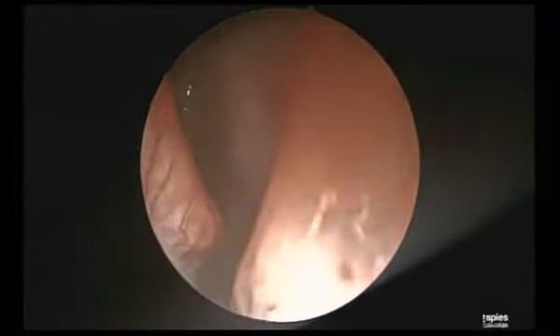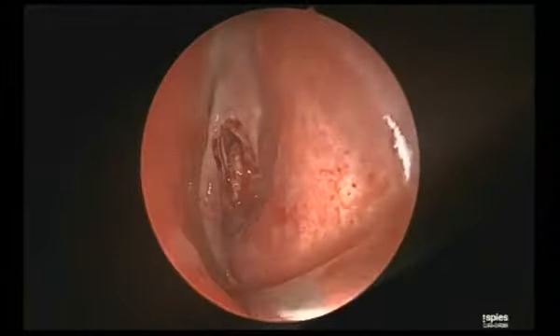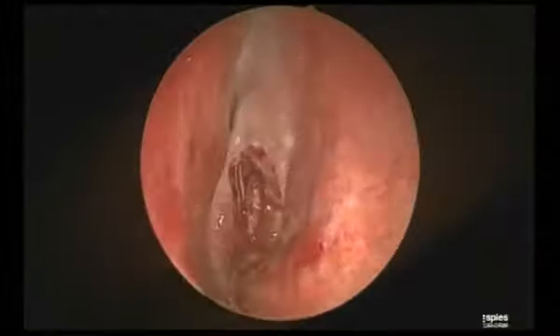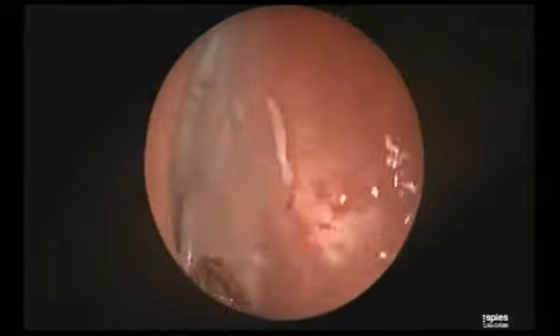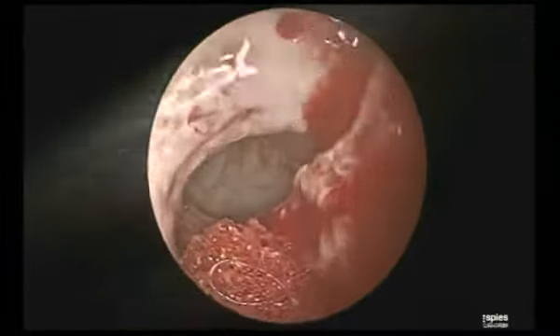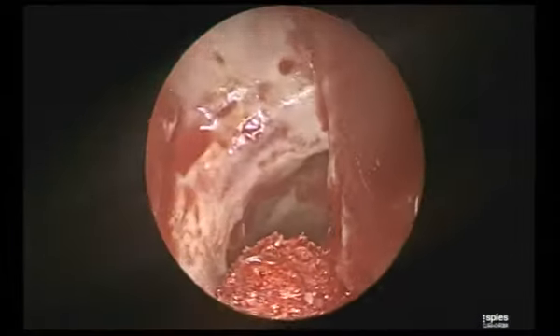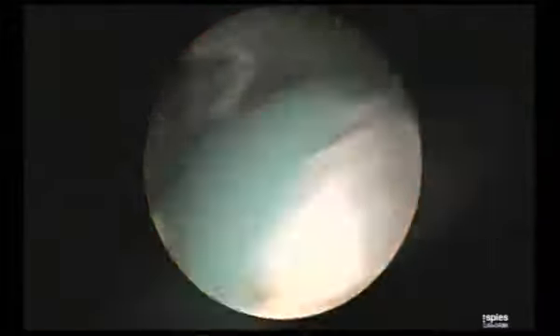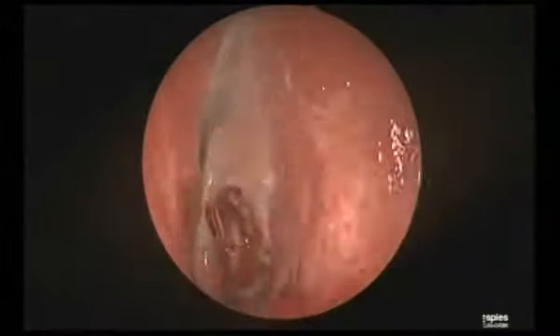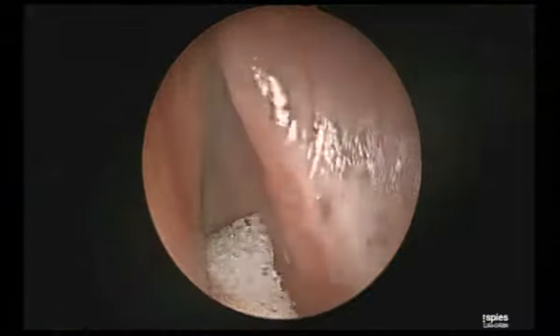In my practice, most of the time when I'm not demonstrating, of course, but doing, I do with a 70 degree only. And that is so versatile, you don't need to change the scope, you can go anywhere. See now, if I rotate the cable, you can see inside the maxillary sinus as well. This maxillary has a little bit edematous mucosa, so I'm not going to widen it anymore. I don't see any need of doing anything like that.